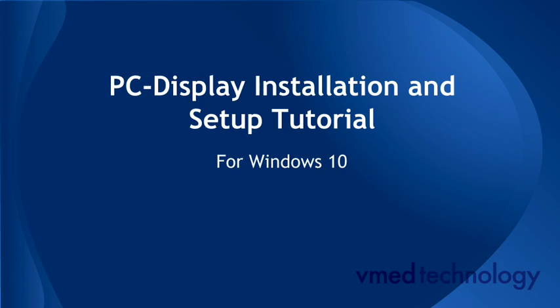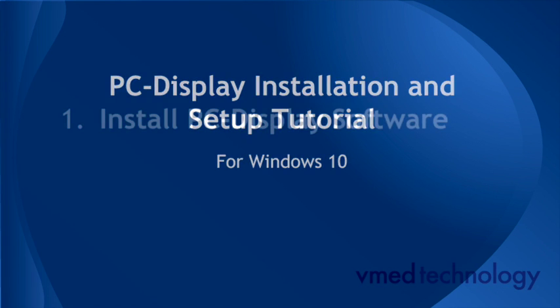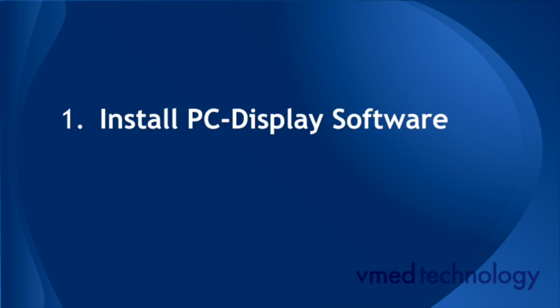Welcome to the VMED Technology Bluetooth Installation and Wireless Monitor Setup Tutorial with Windows 10. The first step is to install the PC display software.